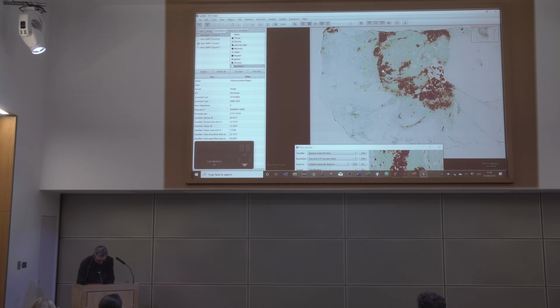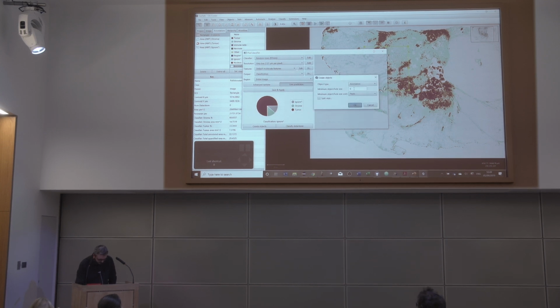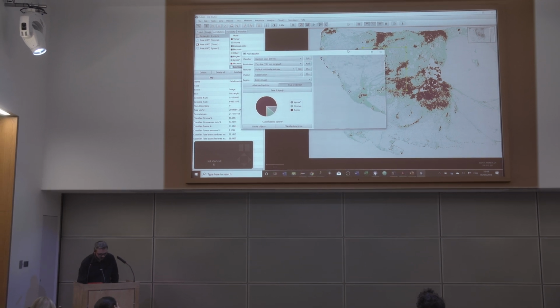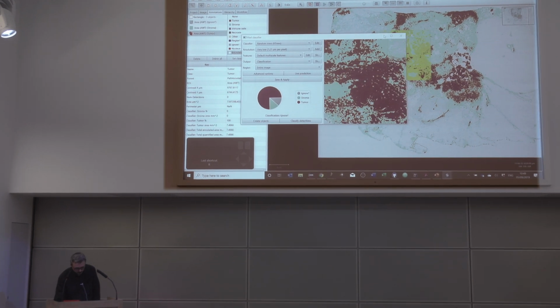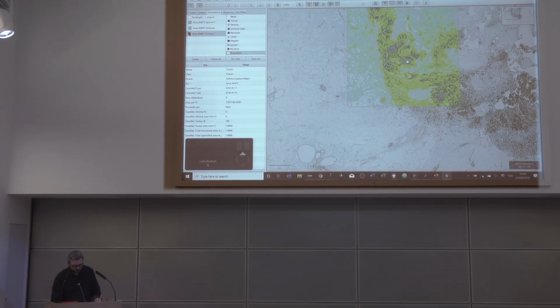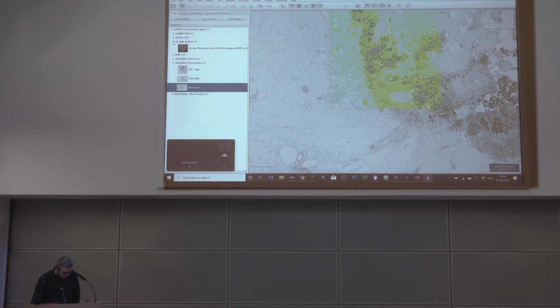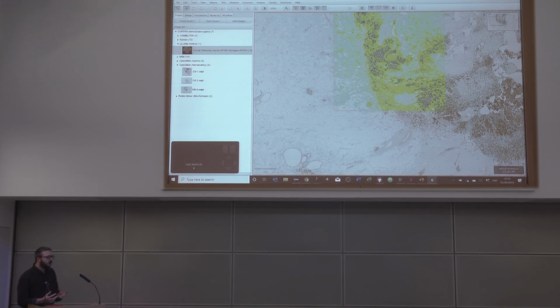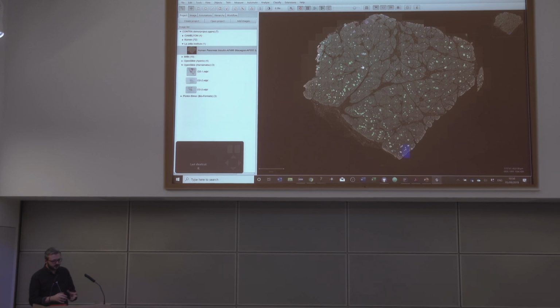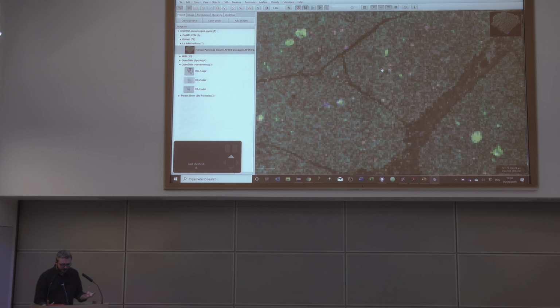Let's see. Whenever you have this, you can then, for example, generate annotations from whatever you've classified. And so, for example, here now we've used this to identify the region that we might want to apply further analysis within. But as I said, my interest is in finding what are the common themes that we might want to solve. And so we can take the same pixel classifier and apply it then for quite a different sort of application.